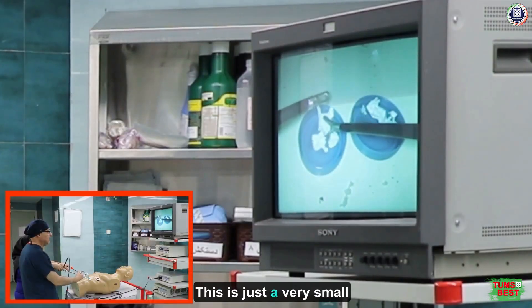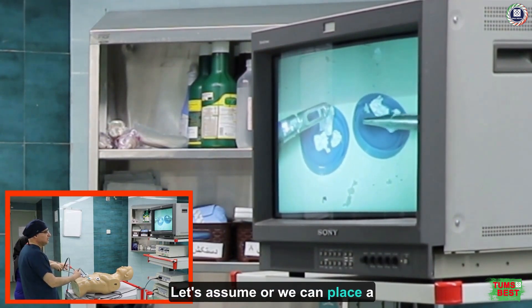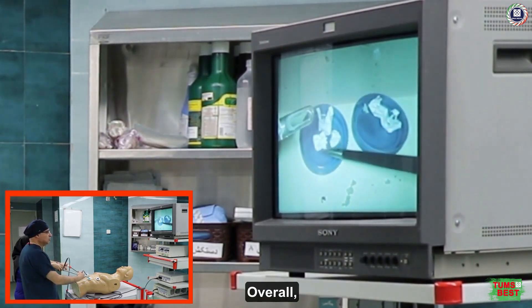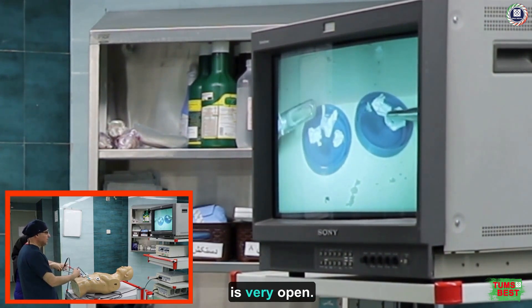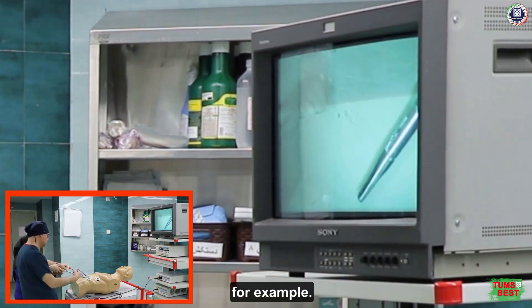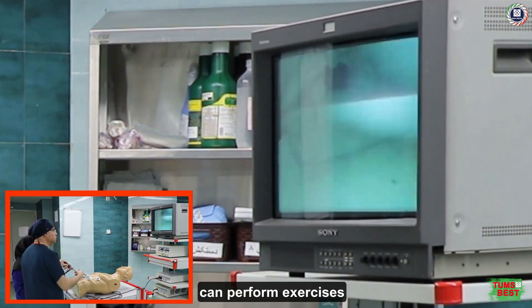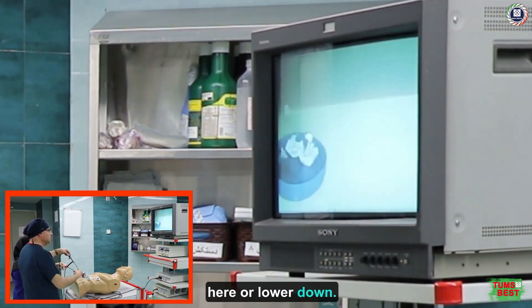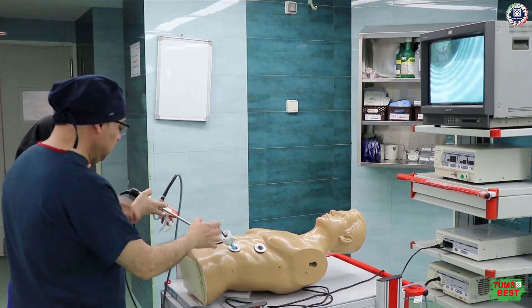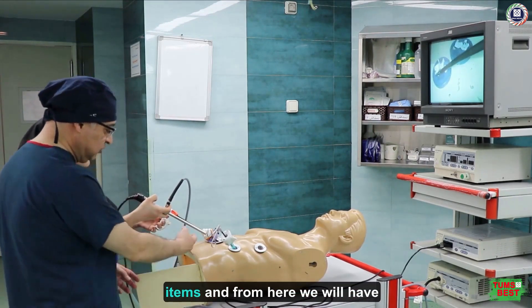For instance, they should perform tasks by moving these small pieces. This is just a small example — we might also place a doll to practice suturing, or put paper inside and try to practice cutting with scissors. Overall, the simulator's environment is very open. There are different areas in the simulator and it's nice that we can perform exercises here or lower down — it completely depends on how we want our working location to be arranged. To move equipment inside the simulator, we use this compartment where we place the training items, and from here we will have complete access to them.